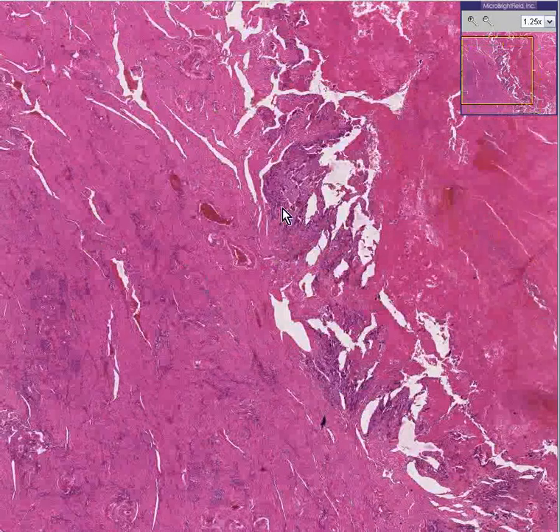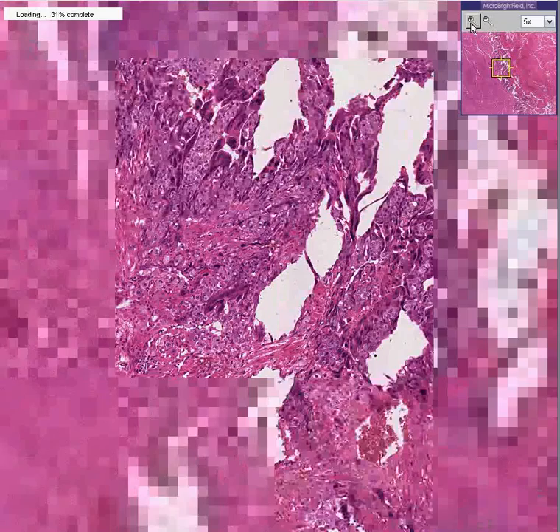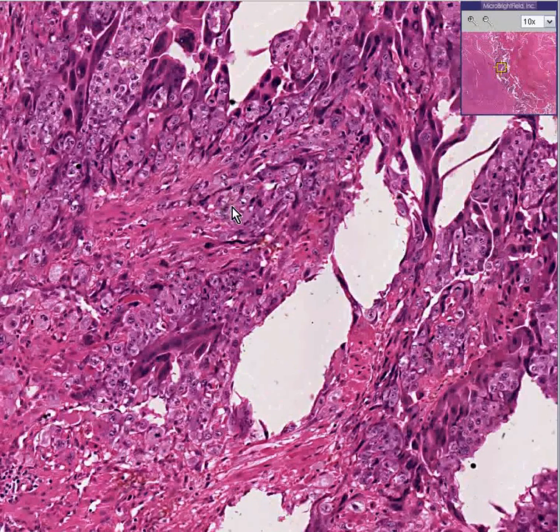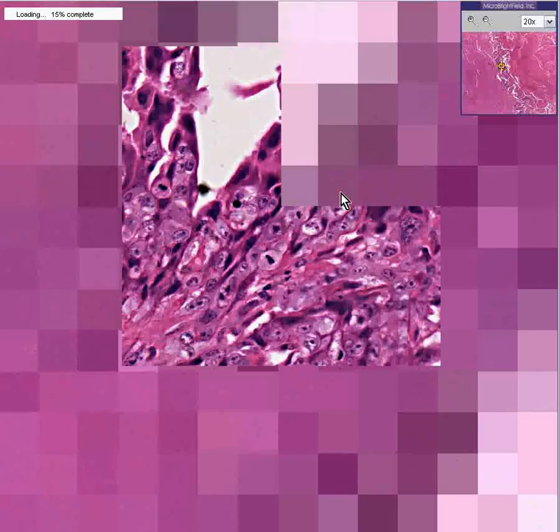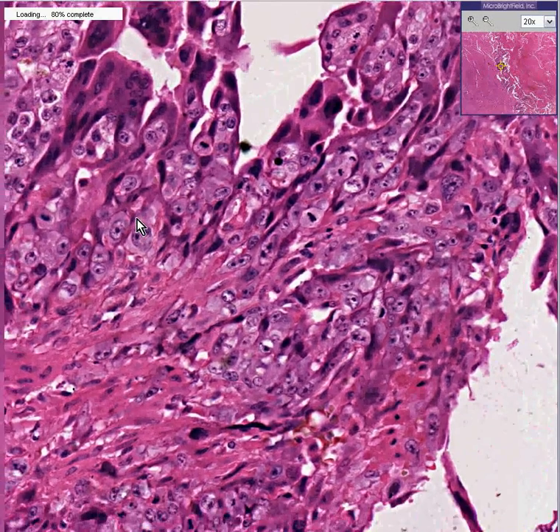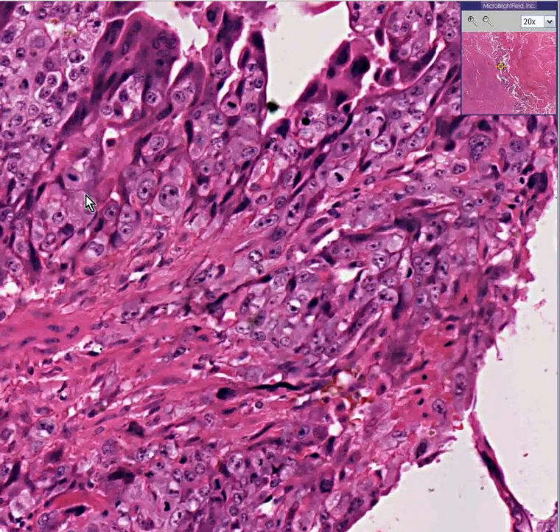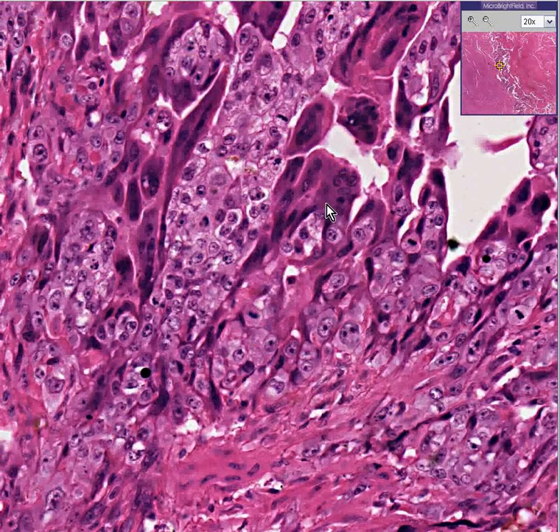Let's take a look at this area and describe the tumor. First of all, it has big plump cells. You can see some of these appear to be in mitosis. Notice how big they are and how big the nucleoli are. Notice how they diffusely invade these smooth muscle cells, and also notice how in some areas they appear to have multi-nucleated cells.